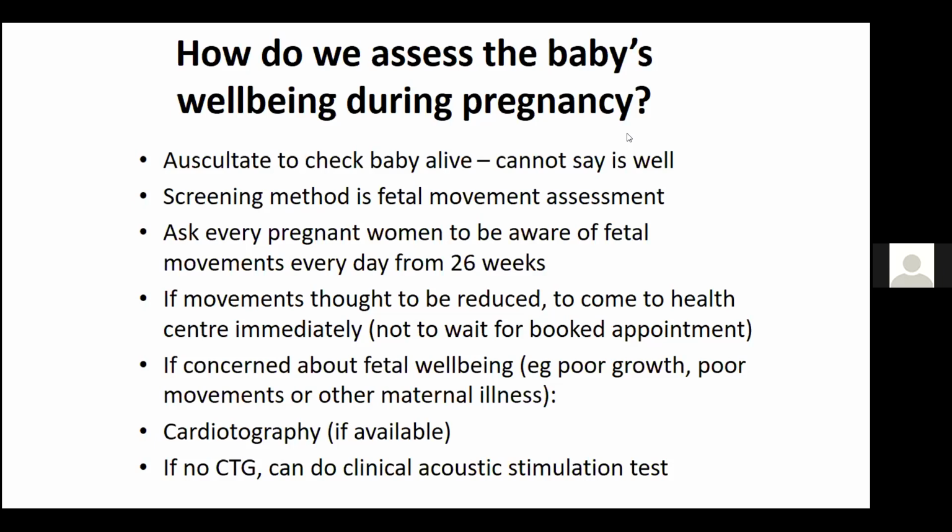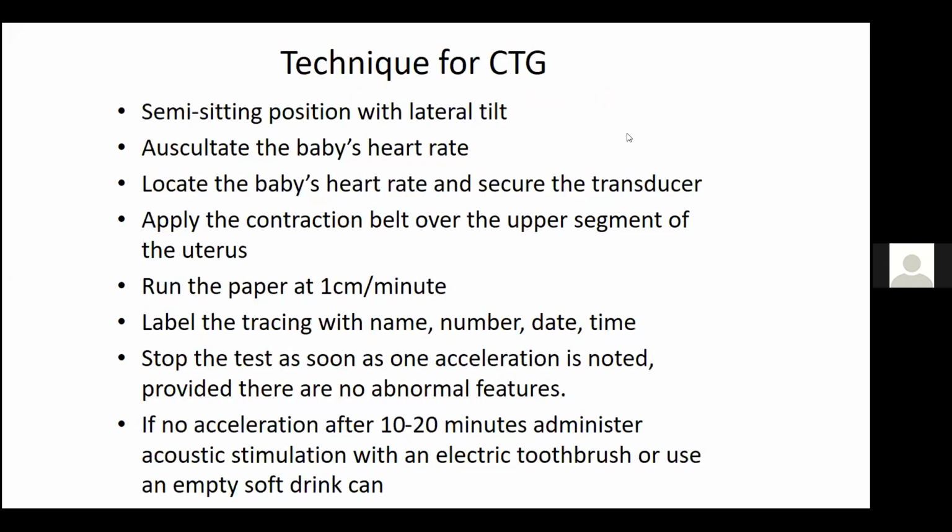And then also, if there is a concern about the kicks, then you need to be checking how the growth was, was there poor growth or what, and then CTGs. Then CTG could be antenatal or intrapartum. So we'll discuss that. And then we'll talk about the acoustic stimulation test.